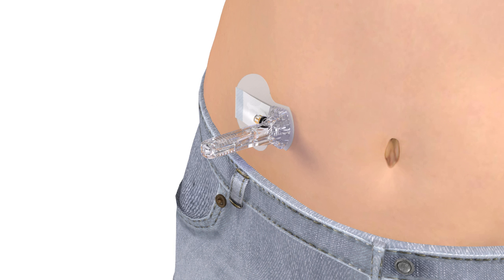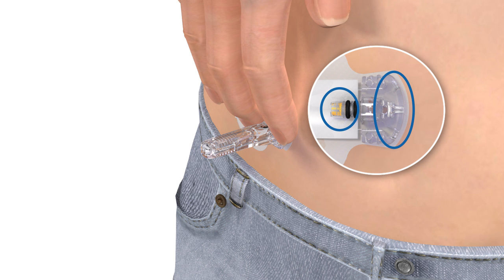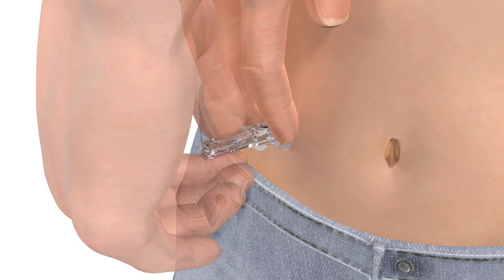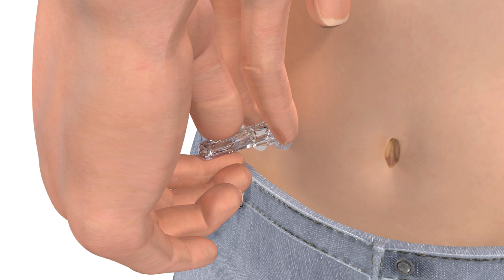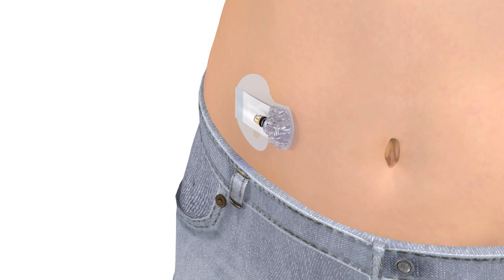With one hand, gently hold the sensor by placing one finger on the front of the sensor and one finger on the sensor connector to ensure your glucose sensor stays in place. Be sure you do not hold or pinch the sides of the sensor. With the other hand, hold the needle housing at the tip and slowly pull straight out, away from the sensor. The needle automatically retracts inside the plastic needle housing.